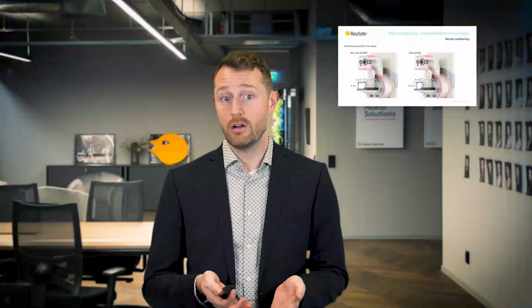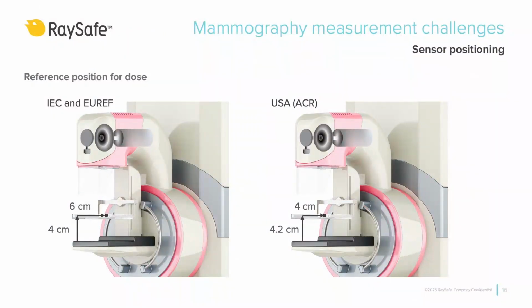Since there are so many parameters affecting the beam quality, it is crucial to have a standardized way of measuring. Otherwise, it will be impossible to compare two machines even if they are of the same model. One has therefore defined reference points where to place the sensor during measurements. Unfortunately, this reference point differs depending on where in the world you are active.